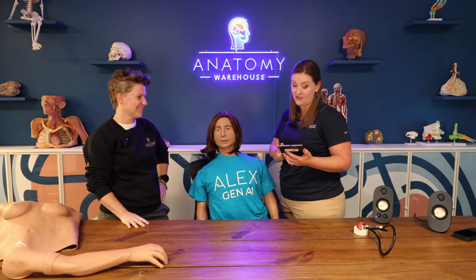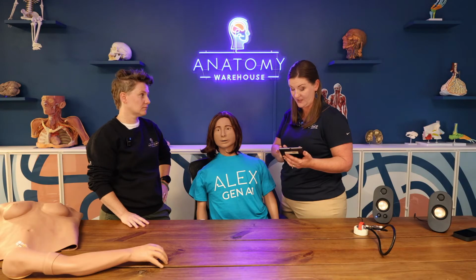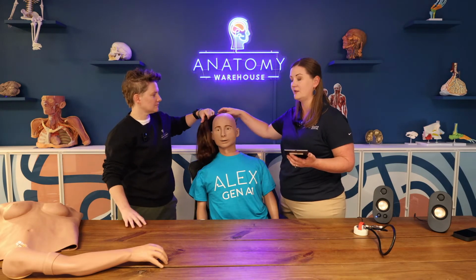So would we like to talk to Andrew P. Landry, who's been in a car accident, or maybe we have Alex Cason, who has some chest pain? Let's talk to somebody who's had a car accident. I think there's a lot that we can unpack with this scenario. Okay, so Andrew P. Landry's a man, so now we're going to change back.